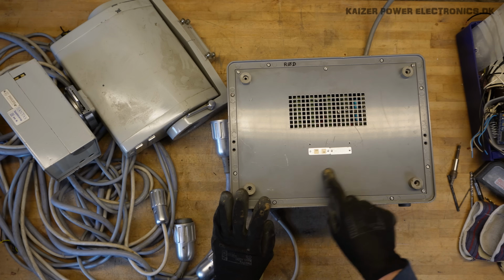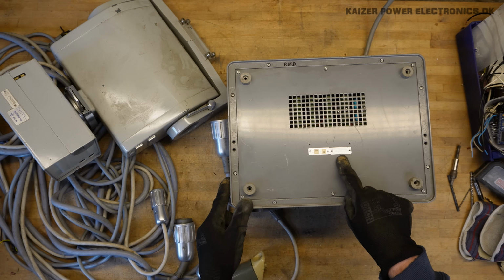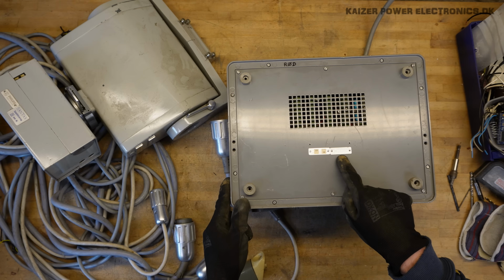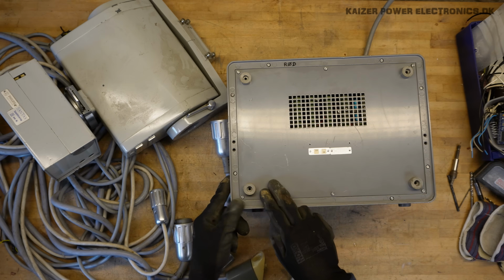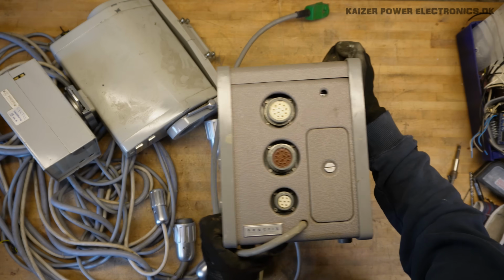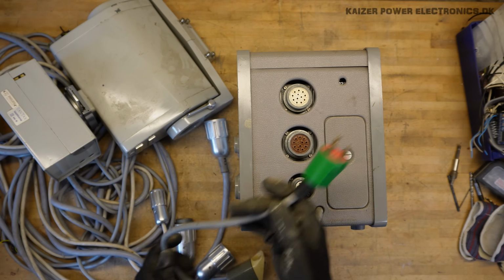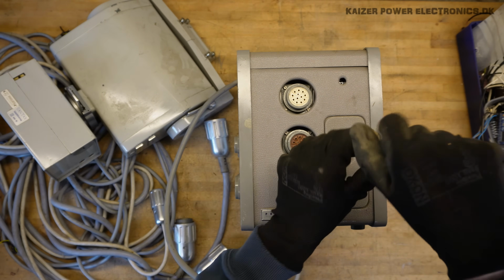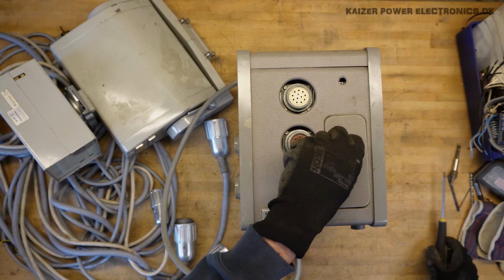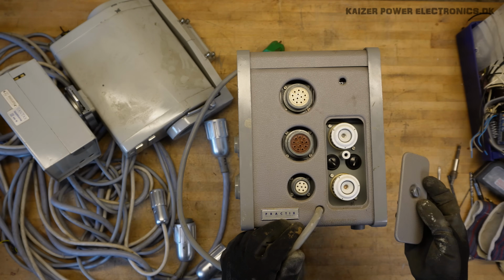On the back we have a type shield, 220 volt, 50 Hertz, and it says it's the type XB7002/00. And that number, yeah, that's just the serial number. Looks like the whole frame will have to come off here. On the connector side we have a white plug, brown plug, small white plug. We have the 230 volt AC connection here and some kind of a lid here. Wonder what that is. Aha, fuses. Nice little service lid.